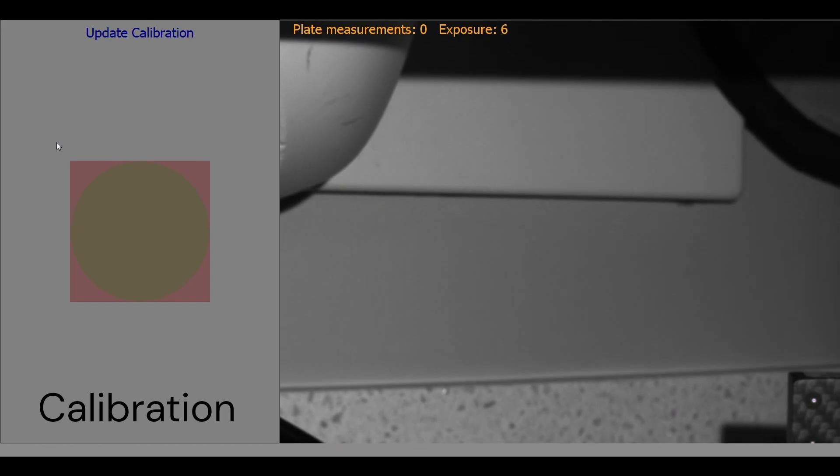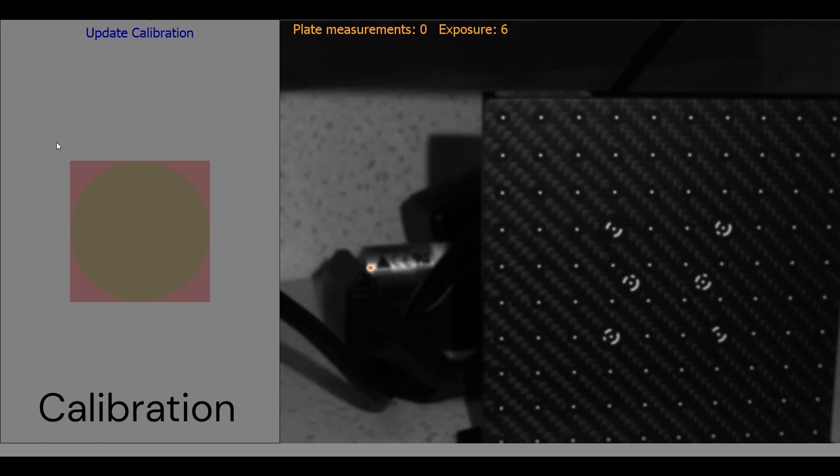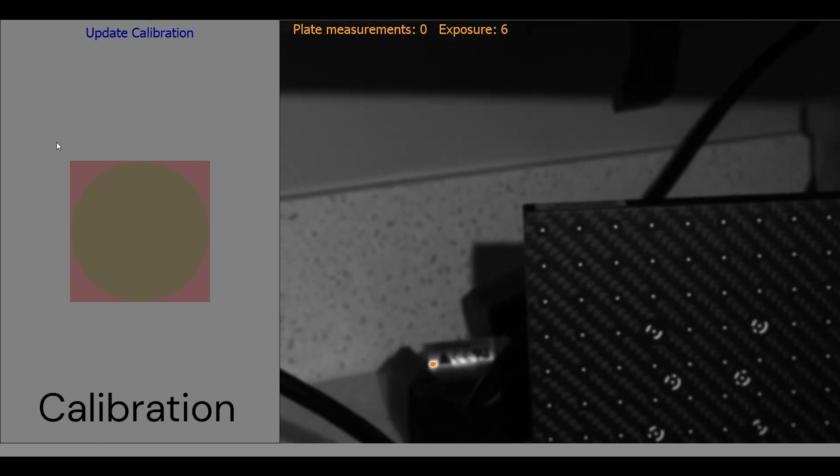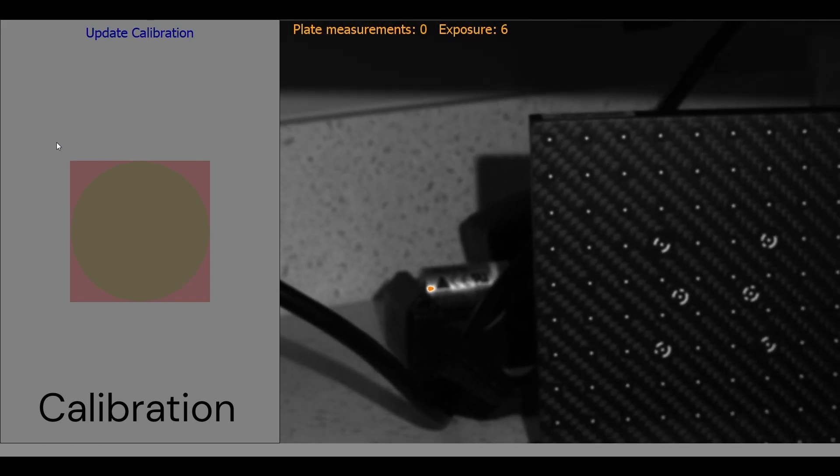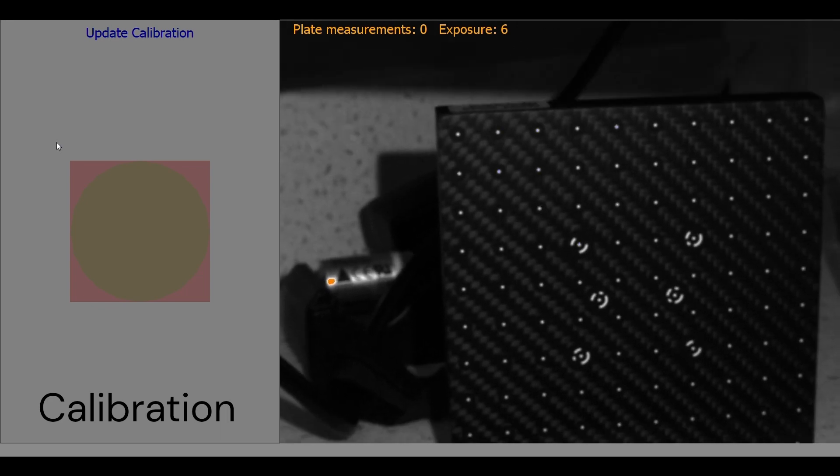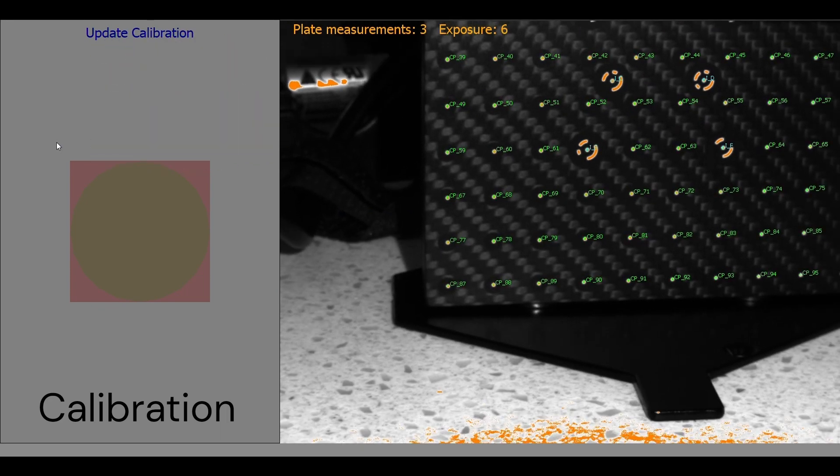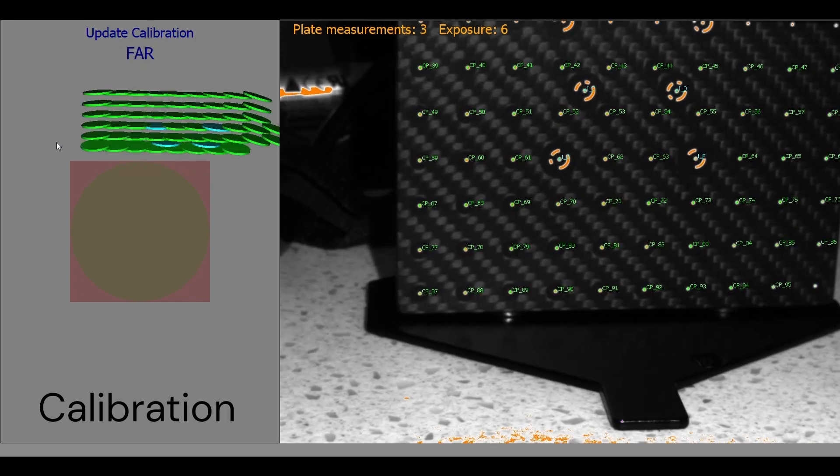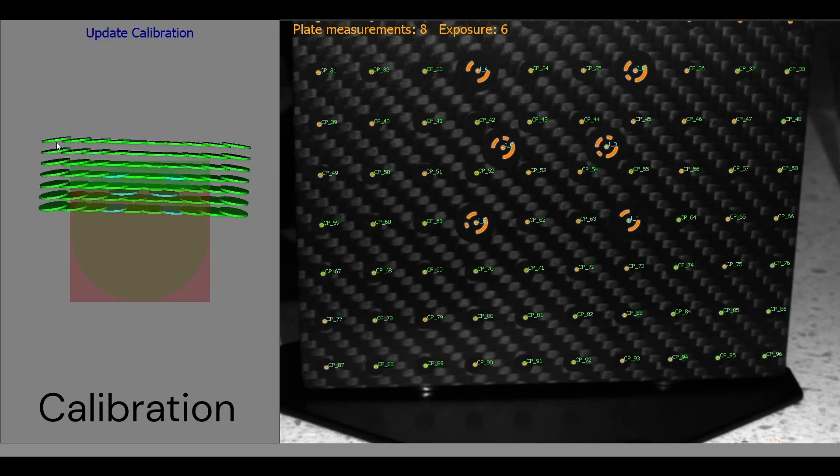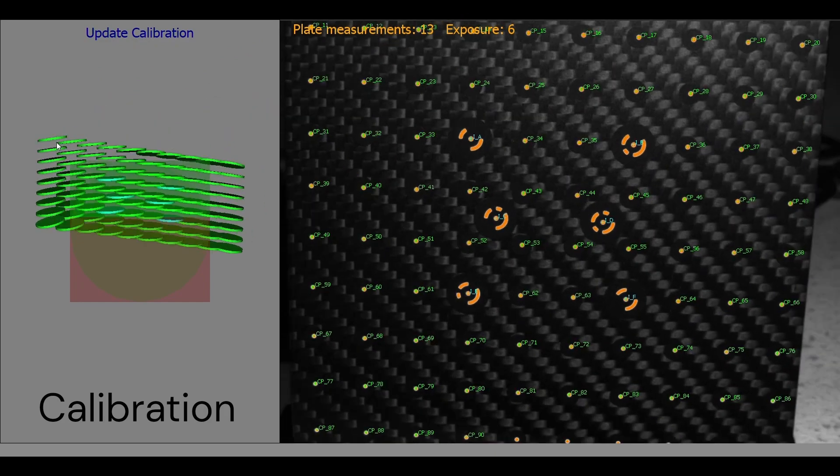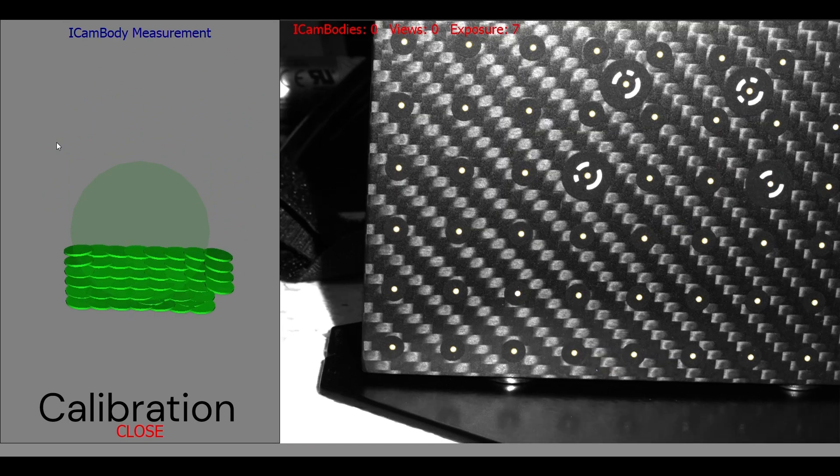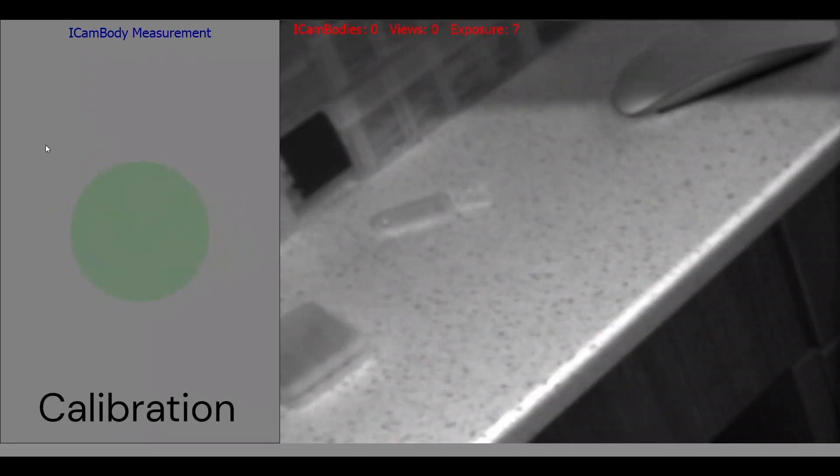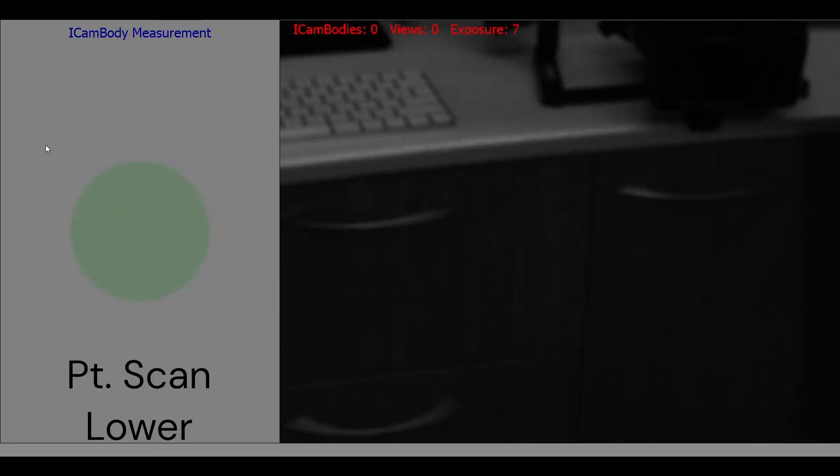What we're going to do is you want to see the six dots within the camera, and then you have this circle over here. So right now I'm too far away. These dots tell you how close you need to be at, and you want to be at like a 30 degree angle, and then you go through. So now we're going to have a better, okay.